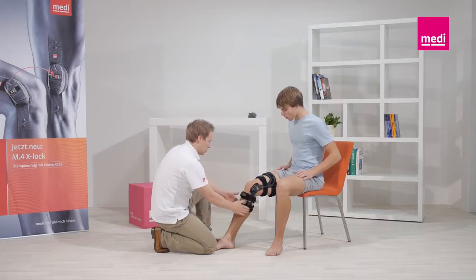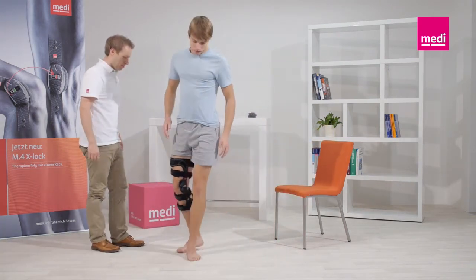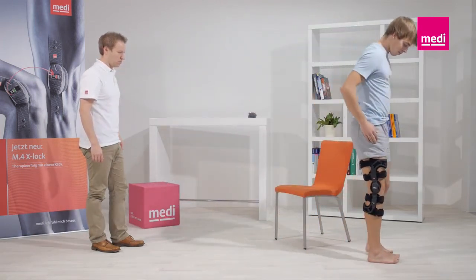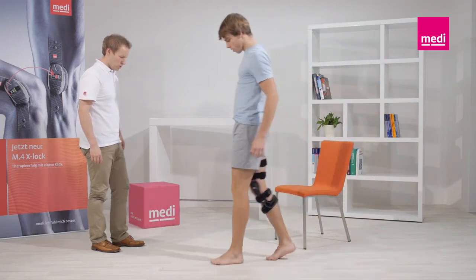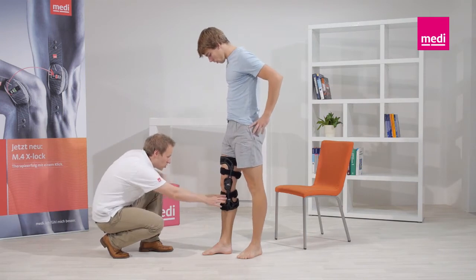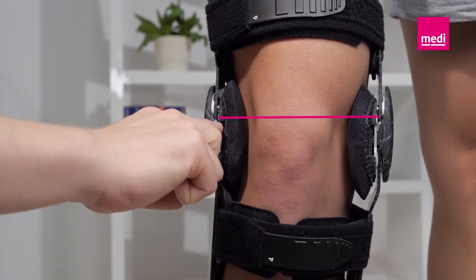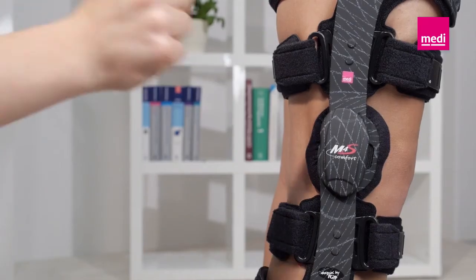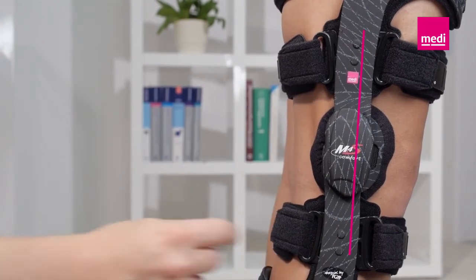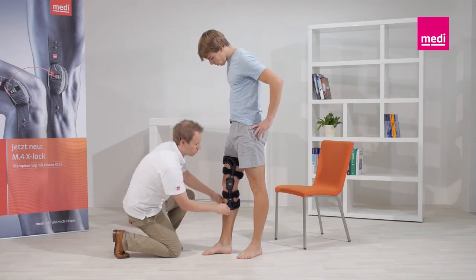Recommend the patient walk a few steps and check again that the orthosis fits properly. As you can see, the middle of the orthosis hinge should be positioned at the level of the superior border of the kneecap and behind the lateral medial midline of the leg. Then pull the straps tight again in the same order to prevent the orthosis slipping.